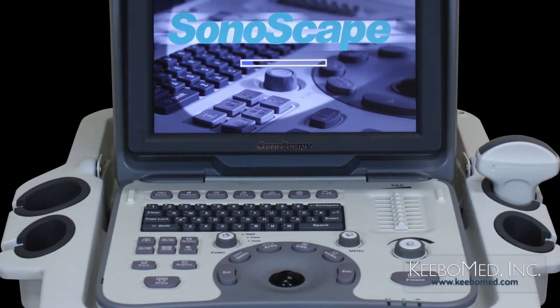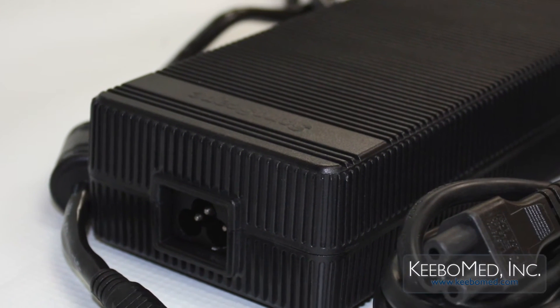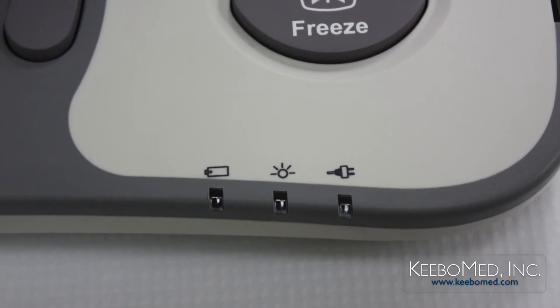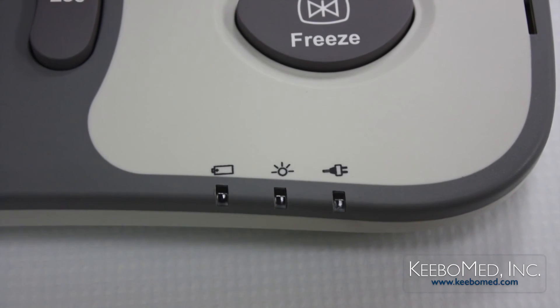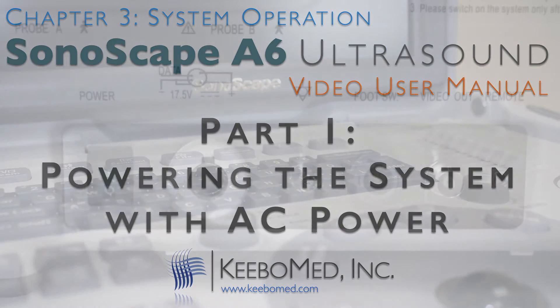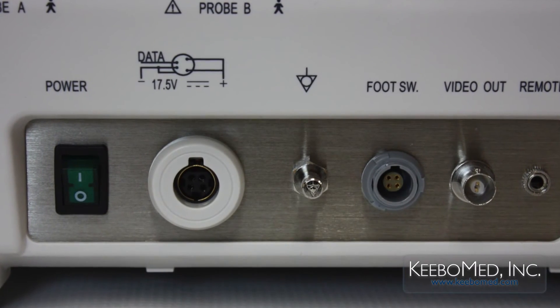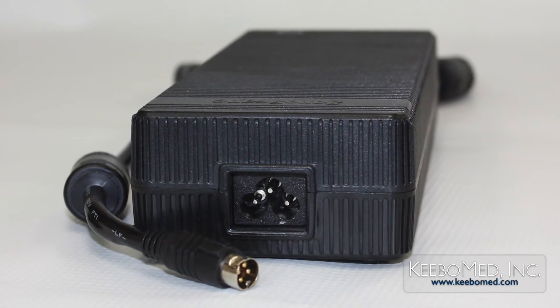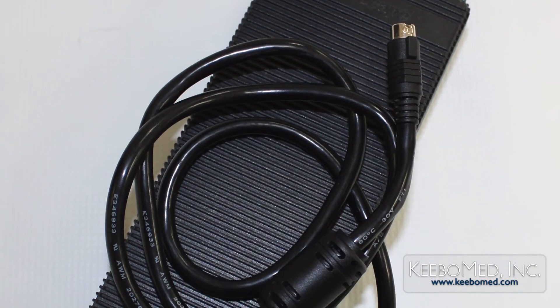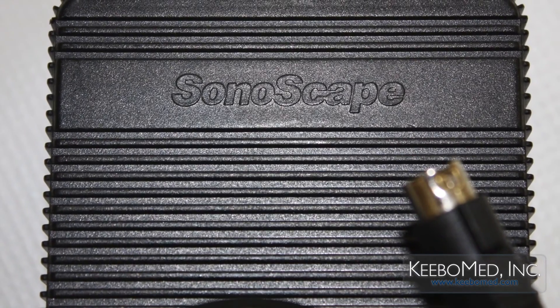The Sonoscape A6 can be powered by two different sources: first, AC power through the AC adapter and power supply, and second, an integrated battery that is pre-installed by the manufacturer. This video will cover the proper procedure for powering the system using AC power. Before connecting the AC adapter, follow these important precautions. An AC adapter is supplied with the system that is specifically designed for use with the A6. To avoid hazard and system malfunction, use only this AC adapter that has been approved by Sonoscape.